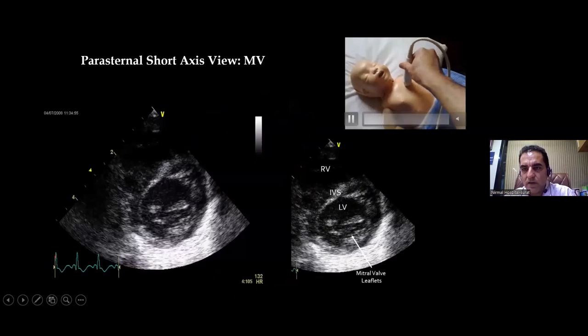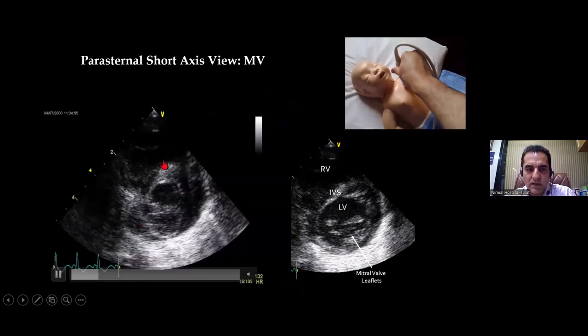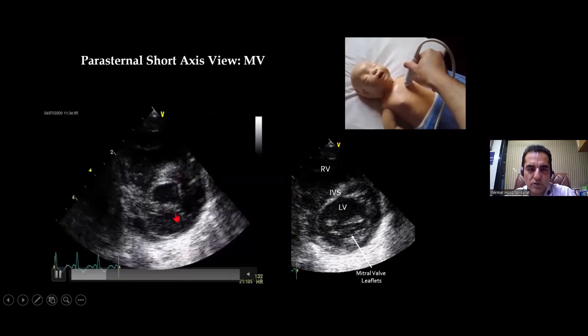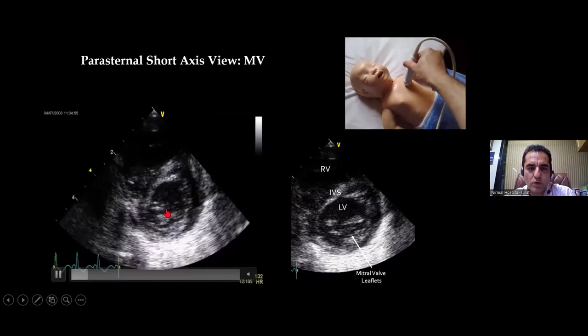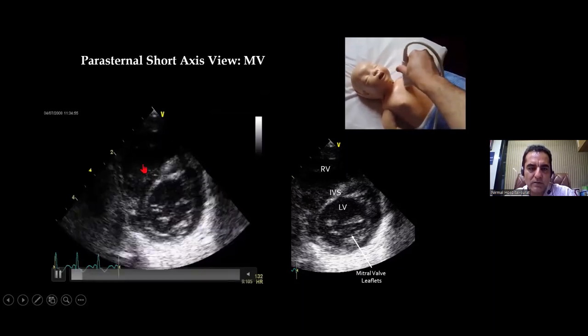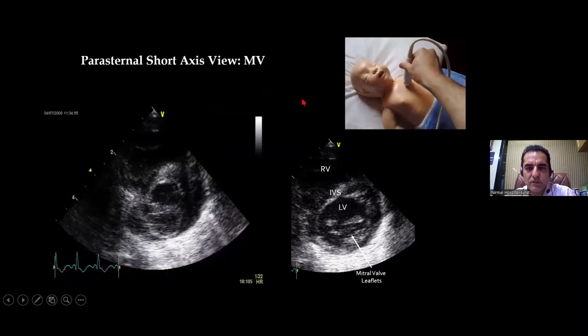Sweeping down from the base towards the apex, this is what you will see — this is known as the fish mouth view. The mitral valve looks like the opening and closing of a fish's mouth. Here you can see the LV, the interventricular septum, the RV, and the mitral valve — this is your fish mouth view.